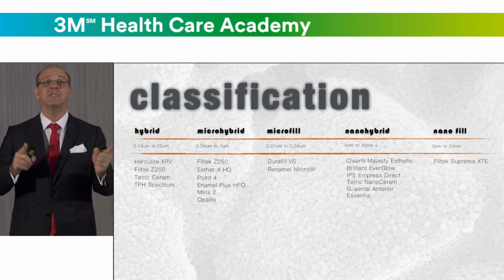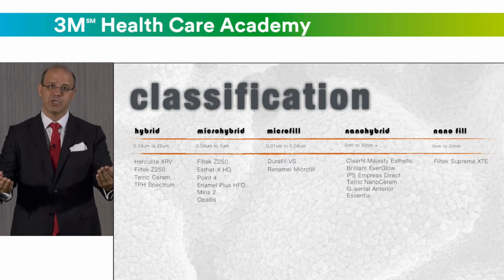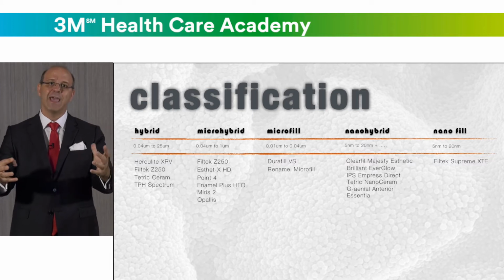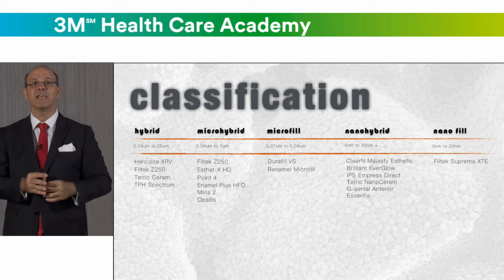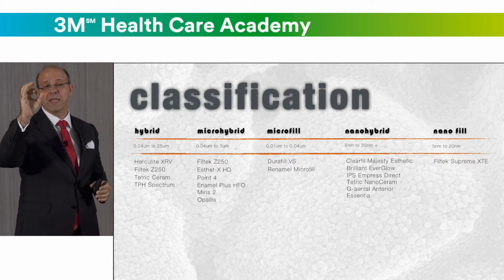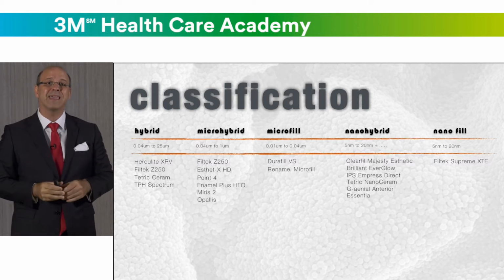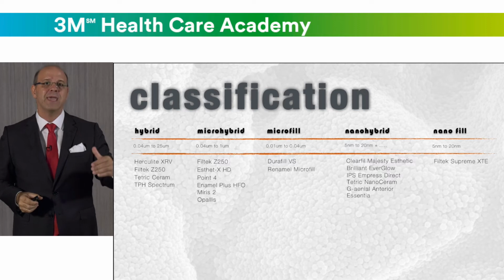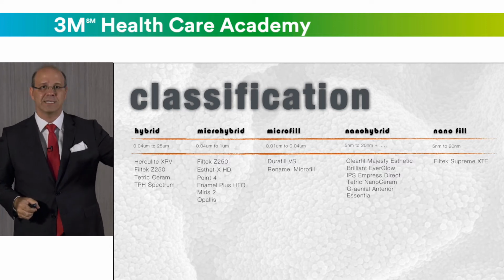But in the anterior tooth, I want a natural, esthetic restoration, and one of the main properties is the polishing. For the composite resins with the filler of the smallest size, it's easier to make a good polishing, and a long-lasting polishing.